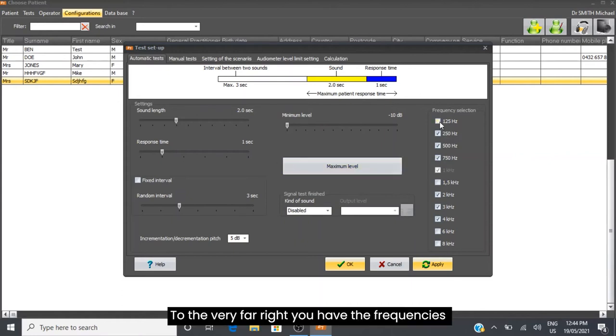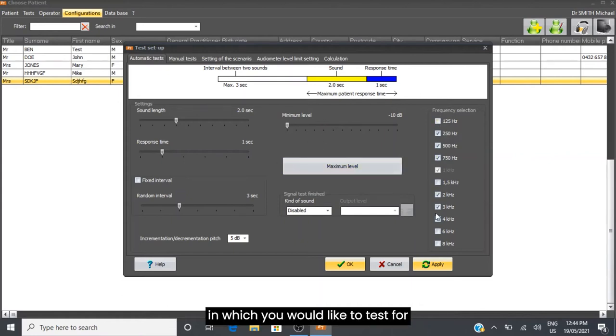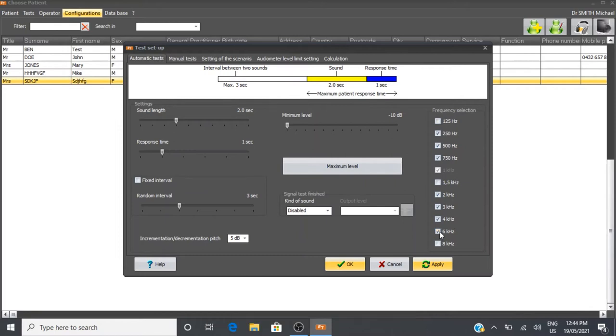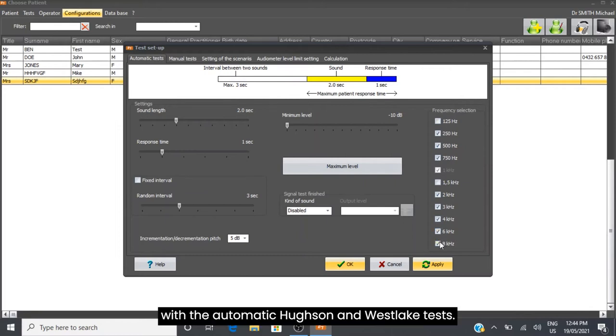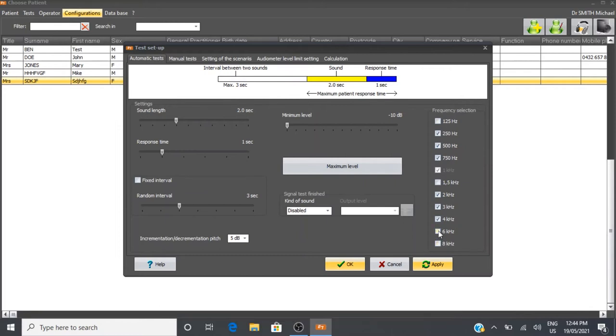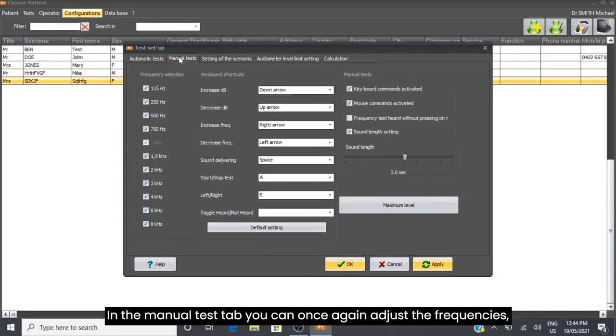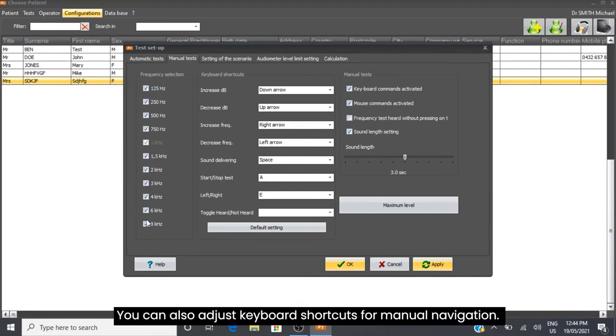To the far right, you have the frequencies you would like to test with the automatic Hughson and Westlake tests. In the Manual Test tab, you can again adjust the frequencies and adjust keyboard shortcuts for manual navigation.